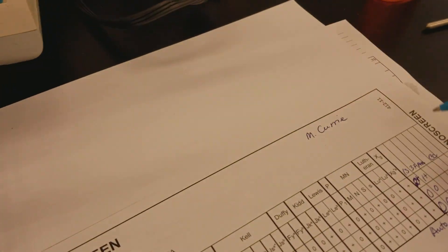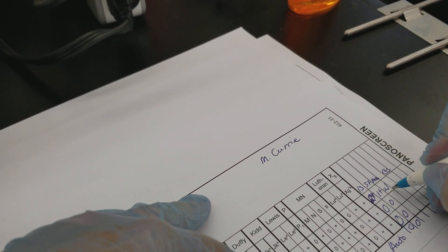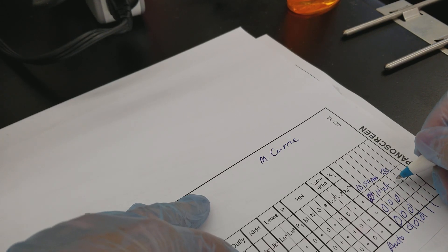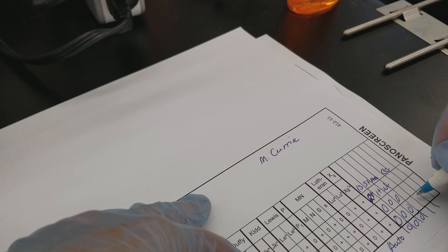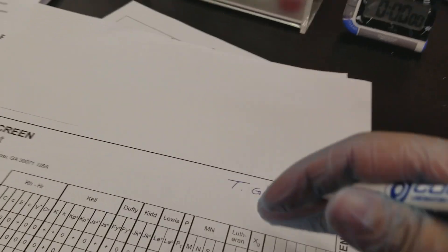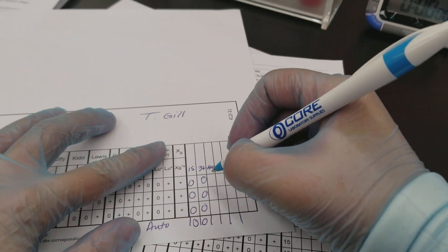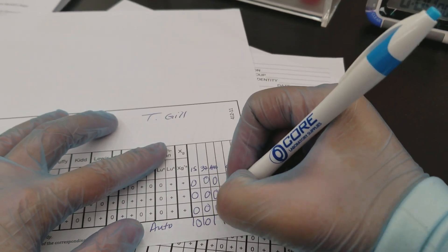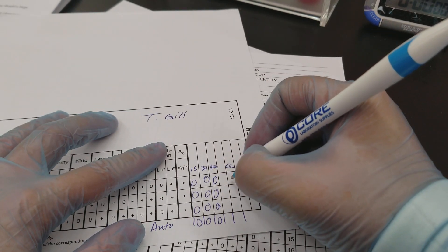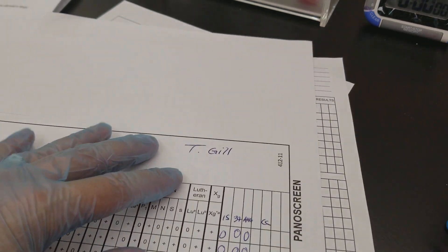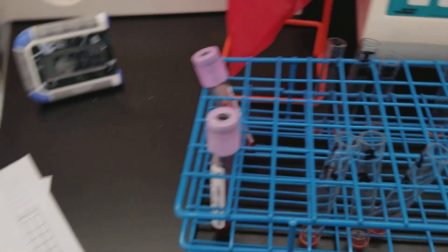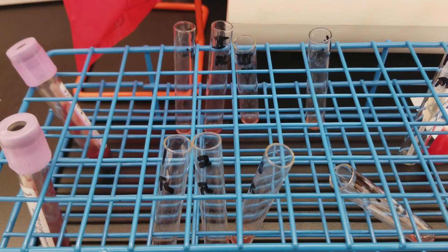All right, so now let's record those. So we have weak positive, and this is negative, negative, negative. So we have to add the check cells only to these three. Okay, with this patient we had negative all the way, so we're going to need to add check cells for all four of those. Okay, so let's do the check cells now.